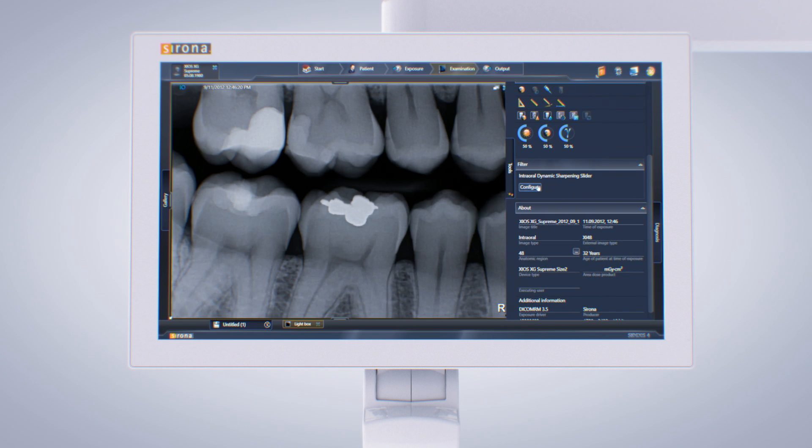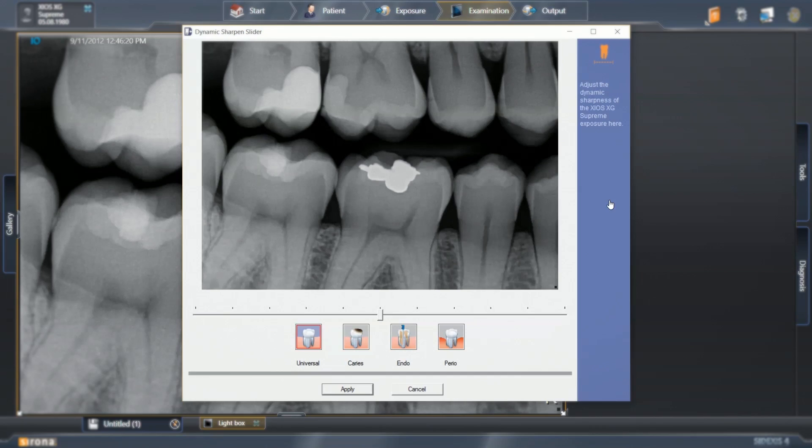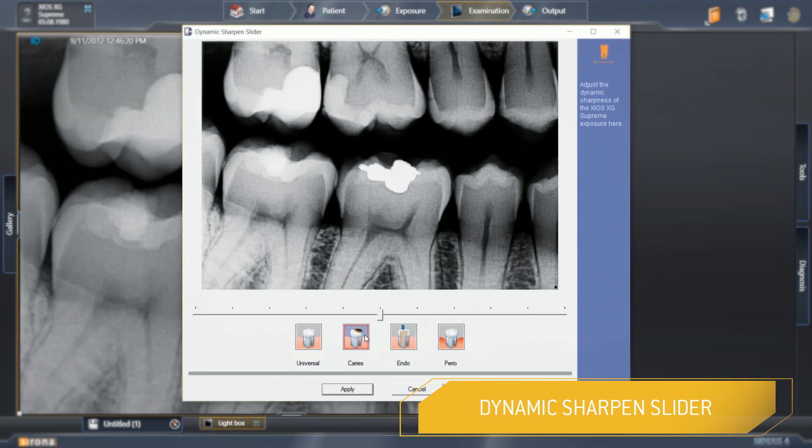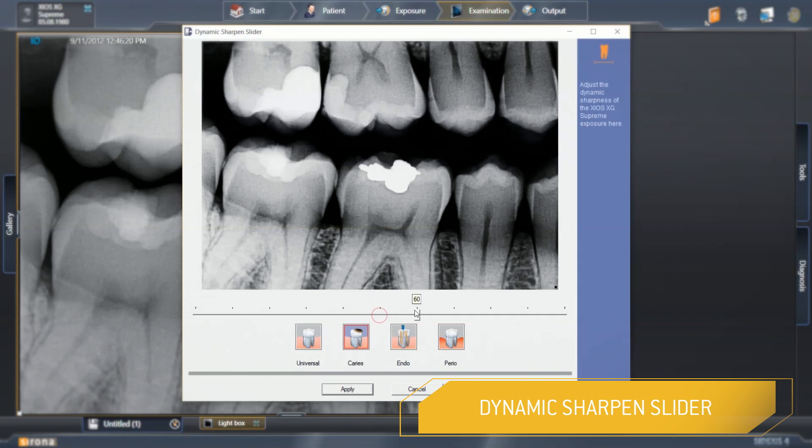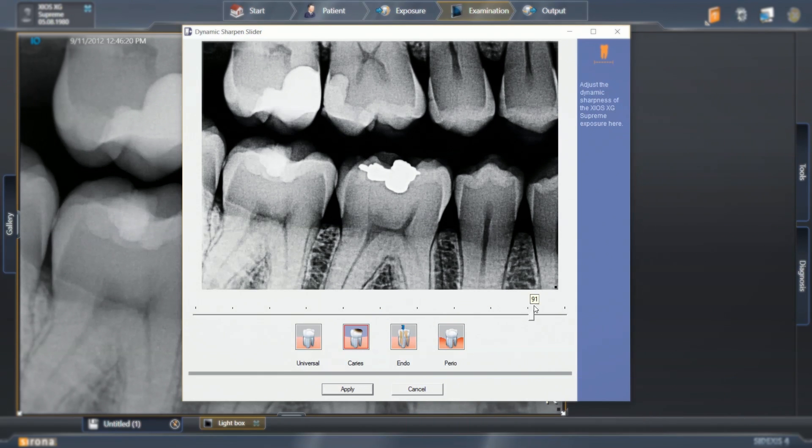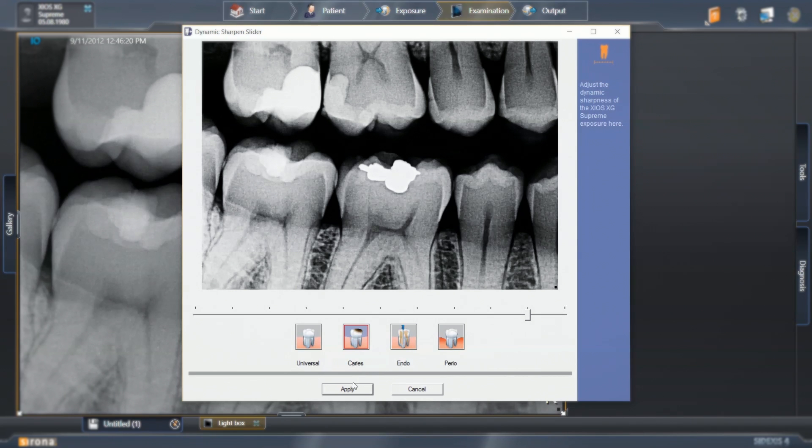Whether it's cavity detection, root canal treatment, or periodontitis, the dynamic sharpened slider and diagnostic tasks allow you to adjust the X-ray image exactly to the patient's situation or according to your personal preference. The intuitive software provides optimal support for your work processes.